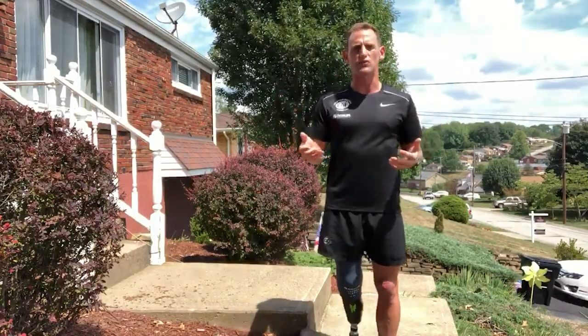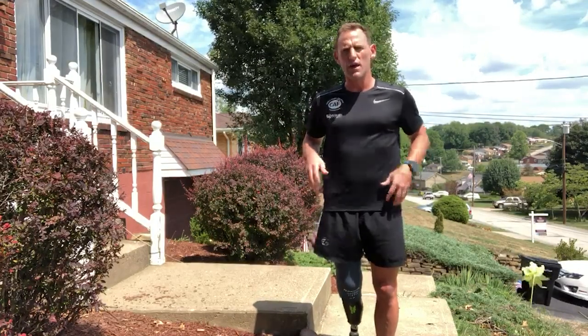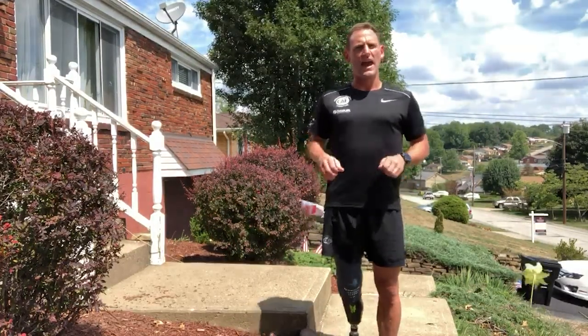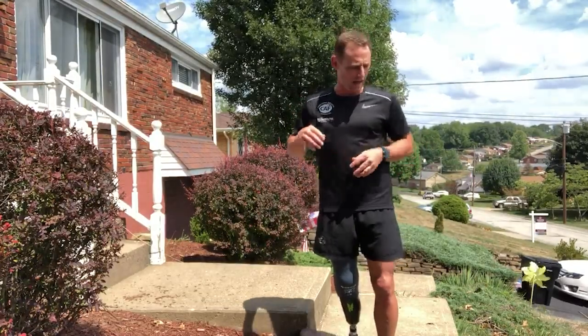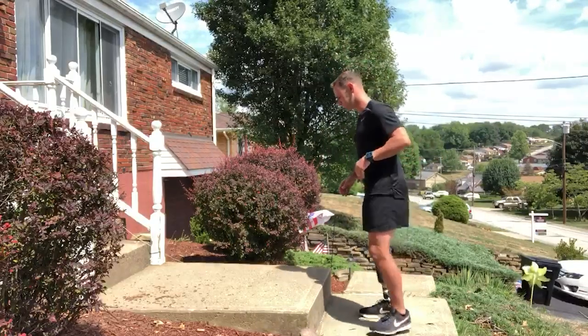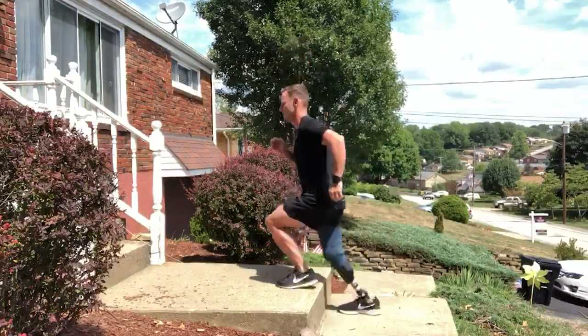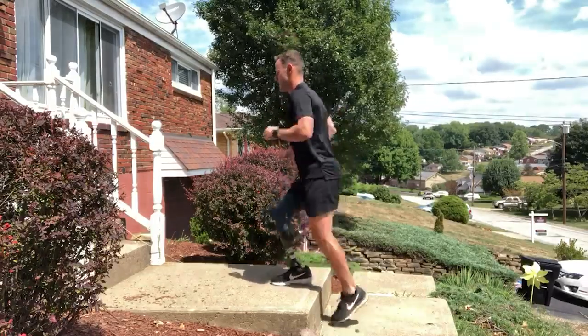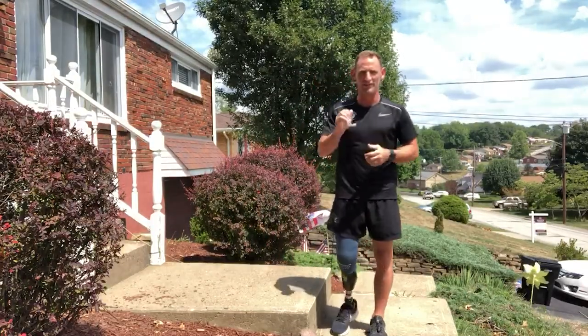You could do a more advanced one. If you're ready for it, this advanced one helps us develop some more rhythm using the alternate legs and gets us used to a little bit more pressure in our prosthetic socket. It's gonna look like this. A little bit more challenging, but definitely worth it.